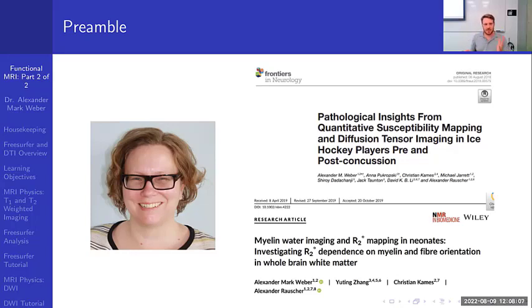So today we're going to be going over 2 things: Freesurfer for anatomical surface-based analysis, and we're also going to talk about diffusion weighted imaging, diffusion tensor imaging. But I'm in no way an expert in the field.